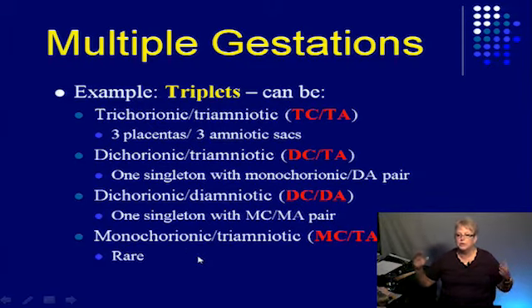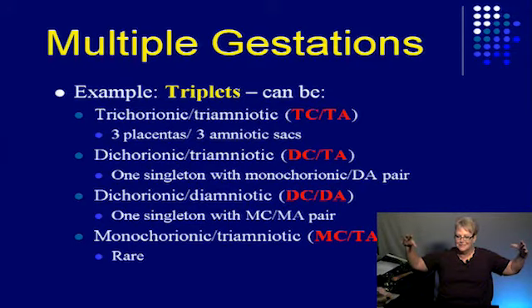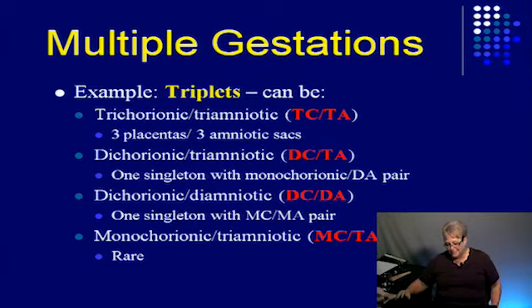But that's what you're doing, is you're counting how many placentas do I have, and then how many amnions do I have? What do they share? I mean, we had spontaneous quads, and it was 2 sets of monochorionic twins. All of them boys.